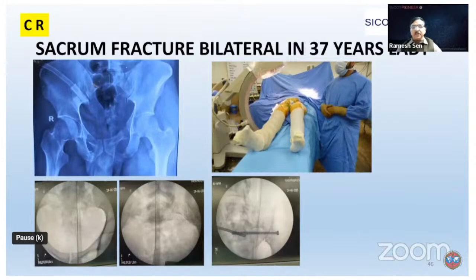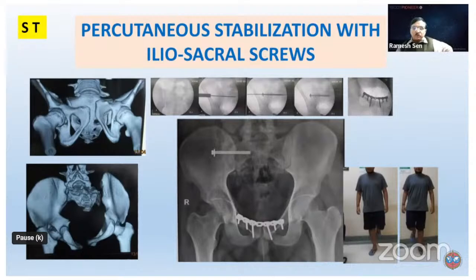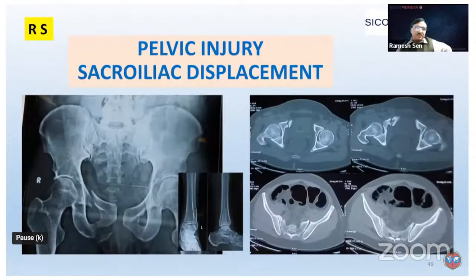Another case, which was an injury from a hang gliding accident where both sides were affected, we did a both-side fixation, and we check after the post-operative CT scan whether we have gone anywhere inside or have accidentally come outside. So CT scan does tell us about that. But most of these cases usually need two fixations, but if the displacement is not significant, sometimes we can manage with one when we are combining it with anterior fixation. But all these vertical instabilities must be stabilized with adequate strength. So you usually need S1 and S2 stabilization.